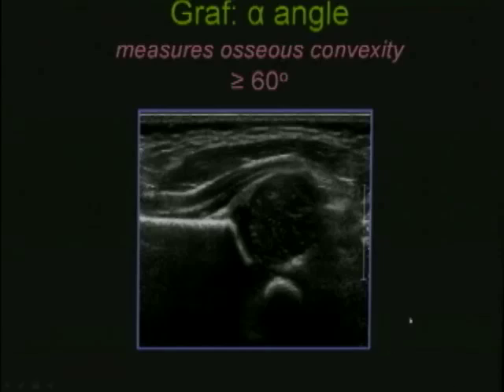So the first thing we're going to do is just go over the anatomy for a last time in this direction. This is the hip in a horizontal plane, so the baby's head is here, the feet are here. This is the iliac bone, the triradiate cartilage, and this is the acetabulum. Here we can see the rounded femoral head, the cartilaginous labrum, the fibrous tip, the joint capsule comes around here, and we have gluteus minimus, medius, maximus muscles.